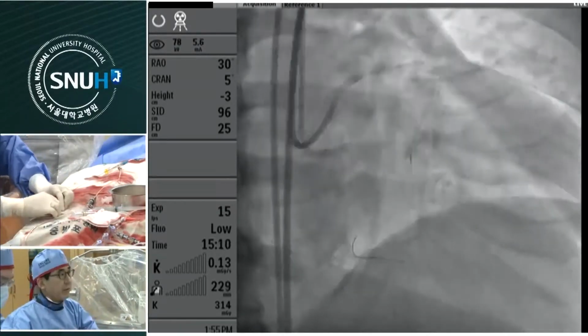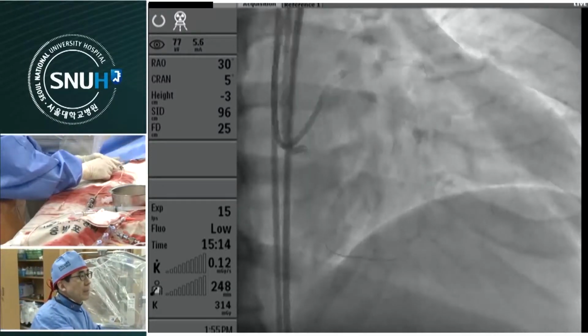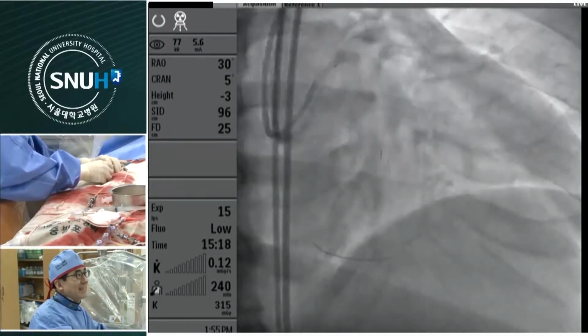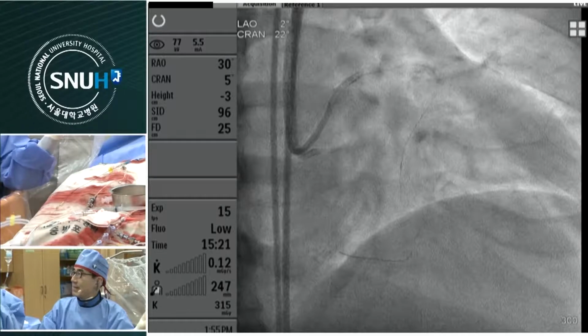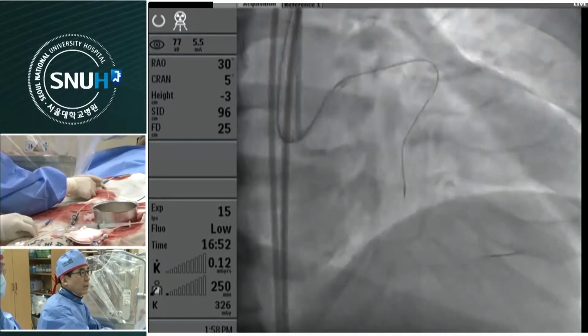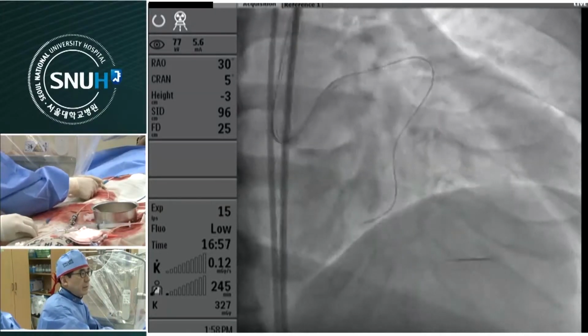Do you have to change to Corsair? Yes, Corsair. This is Japanese, I think, in the company. The microcatheter is very slippery and tapered, a very excellent one. It's a different vessel. Can you tell us which this is? This is Corsair Pro. The penetration force is significantly better than Caravel.